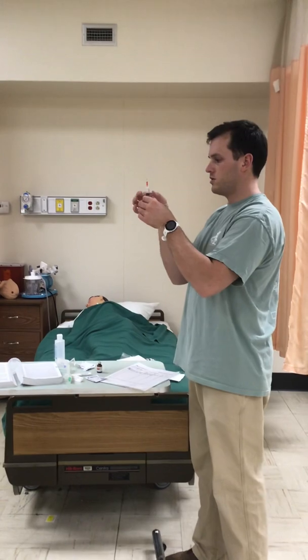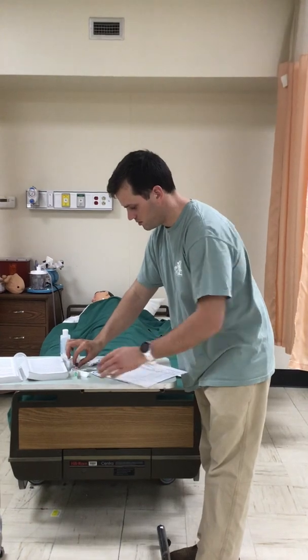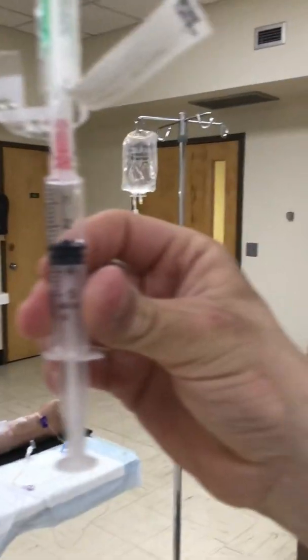Going to make sure that there are no bubbles. I'm going to recap my syringe. And as you can see, that is 3 milliliters.